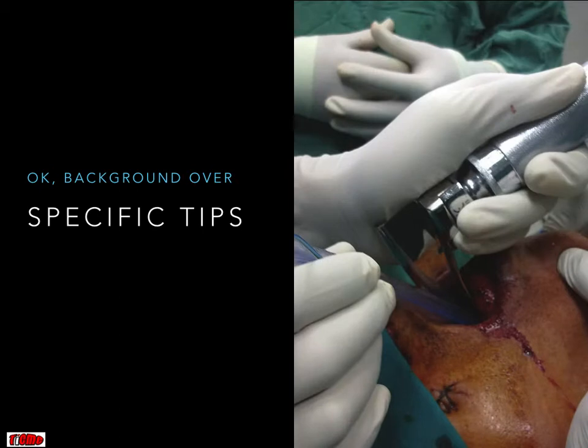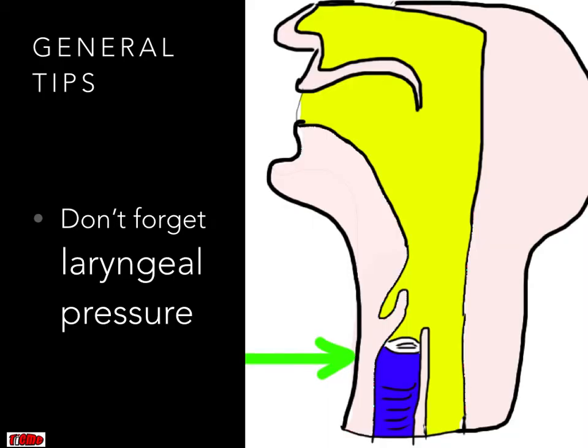So we've talked about the differences between the geometry and how you might use these devices. Now we're going to specifically go through each of the devices with tips for their use. Firstly, with both devices, never forget yourself or an assistant giving laryngeal pressure, which helps to move an anterior larynx posteriorly into your field of view.